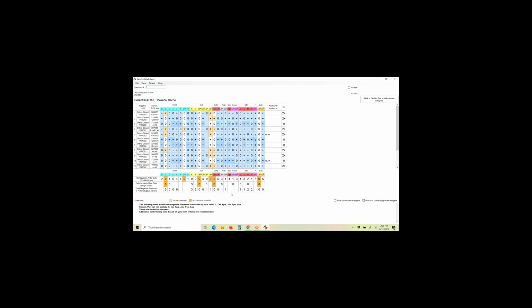And we have the orange that we need to pay attention to. So we have the CW, the KPA, and the Lutheran A that are our lows. So we can hide that. It doesn't get rid of the orange, but it's the low incidence.